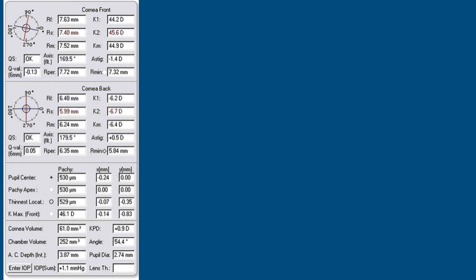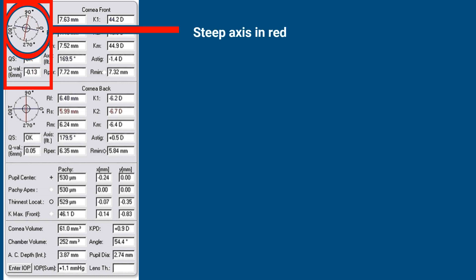Right here in the top left corner, there are three things — these circles and two values. The red circle is the steep axis, represented in red, and this is actually K2, which is the steep axis.